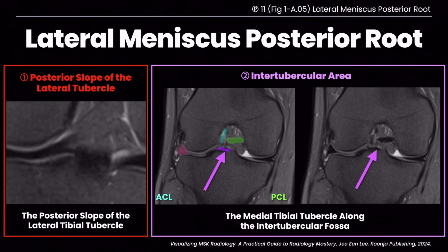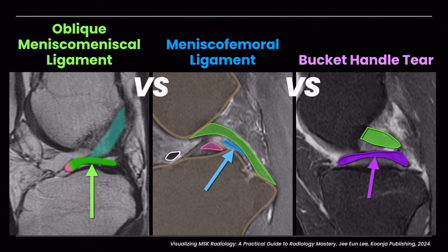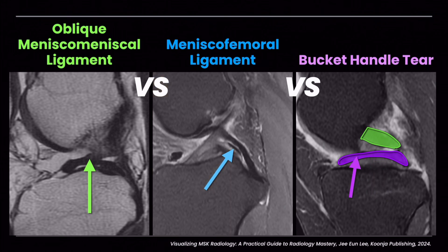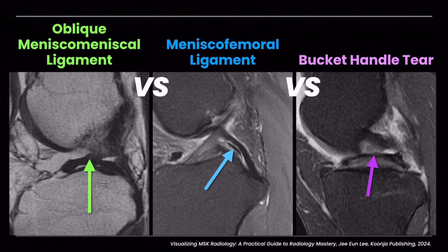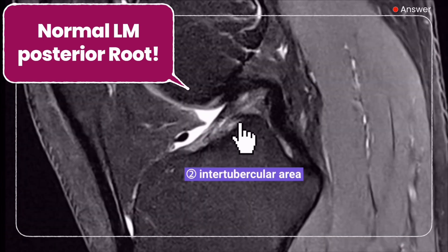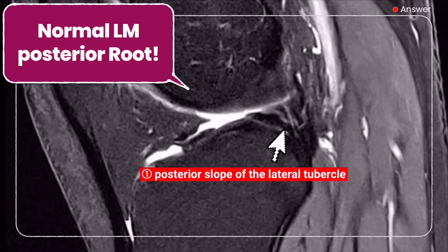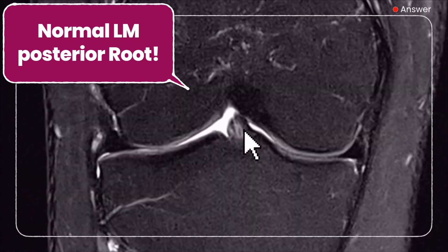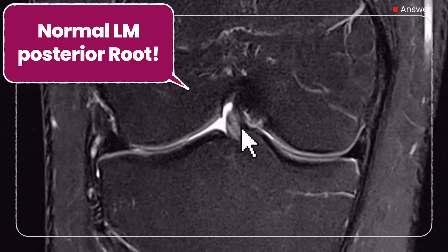Now, let's talk about common diagnostic pitfalls. The posterior root of the lateral meniscus can be mistaken for the oblique meniscomeniscal ligament, the meniscofemoral ligaments, or displaced meniscal fragments in bucket handle tears. We will explore each of these mimickers in more detail later. For now, remember this: always trace the structure back to its meniscal origin and bony insertion. And keep in mind that even if you see only one component, it does not necessarily indicate a tear — about 24% of individuals have a solitary attachment.